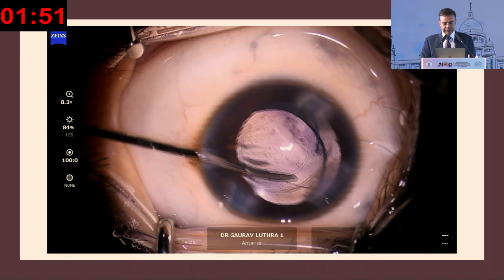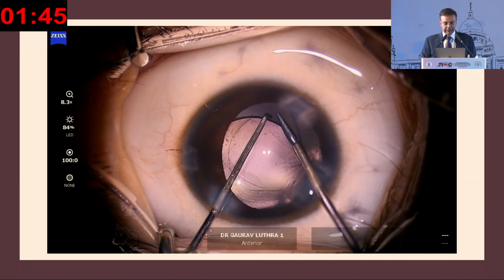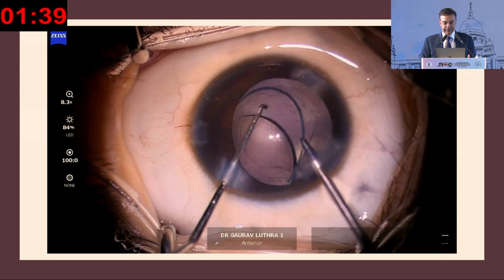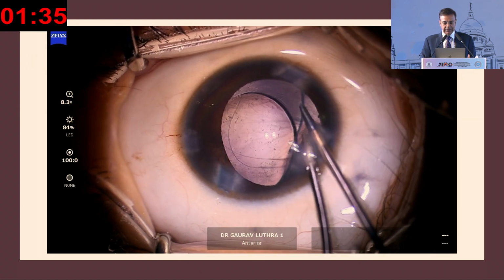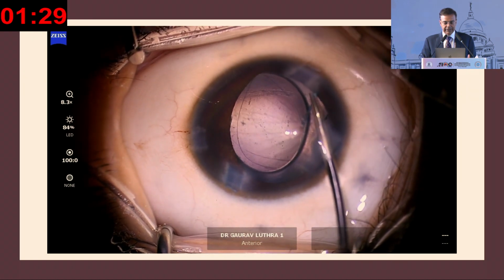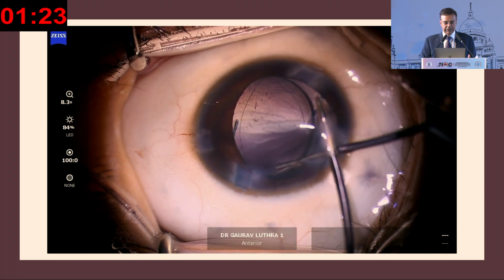Found it difficult to make, so I created another small port, and now I have a rhexis which is about 5 millimeters in size. Now I'll go with the forceps and make sure that I'm not making mistakes, because this IOL can sink, and get the one haptic out, keep the lens stabilized, pass it to the other hand, and then using a second instrument get this thing anterior to the bag through the smaller rhexis, because the rhexis is still smaller than the size of this optic.